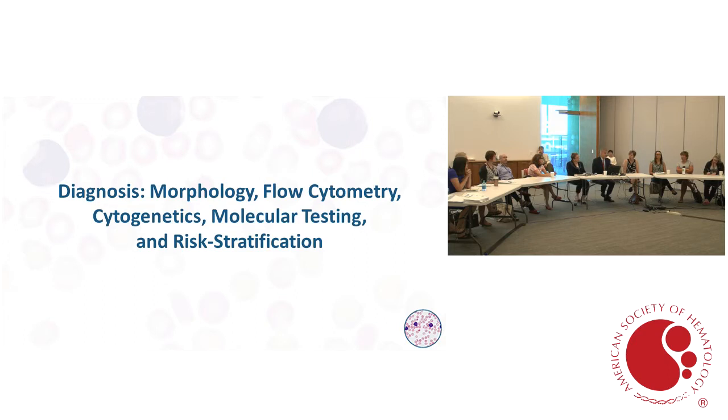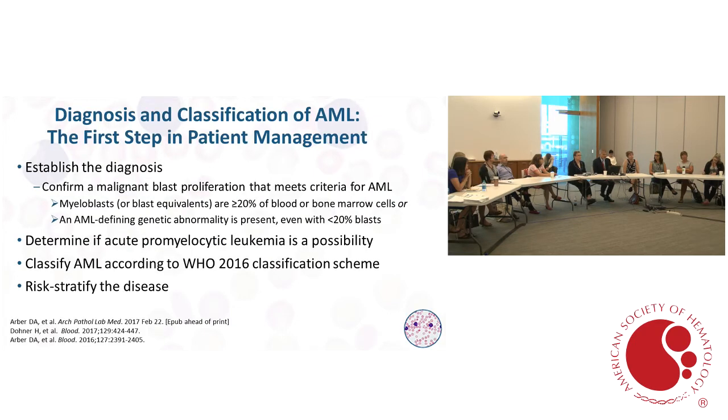And I would say if there are issues, then it's good for people to work together to find out what the problem is. We've had some issues recently with cores that are very small and not so great and hemorrhagic, and we've worked with the hematologists to try to get better cores and find out why we were getting those. So I think it's important to get a good sample, not only for all the ancillary tests, but even just for the morphology, for getting the correct blast count.